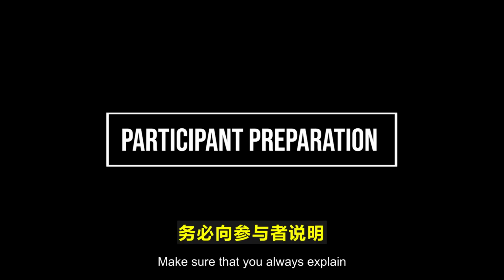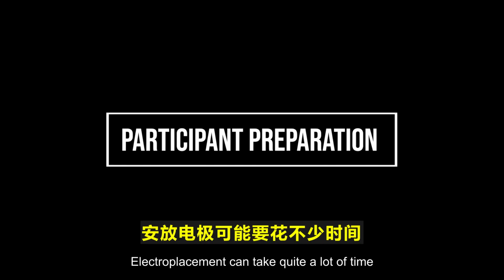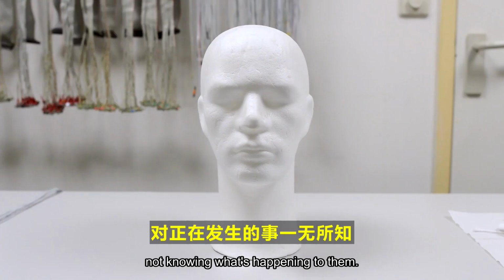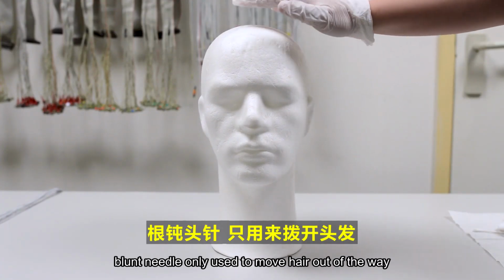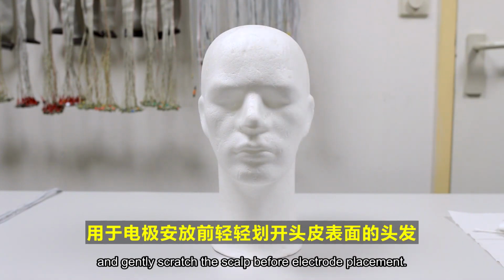Make sure that you always explain to the participant what you are doing to them, even if it may seem unimportant to you. Electrode placement can take quite a lot of time, and nobody likes to sit in awkward silence, not knowing what's happening to them. Be especially sure that you show the participant the needle you will be using and explain to them that it is a blunt needle only used to move hair out of the way, and gently scratch the scalp before electrode placement.